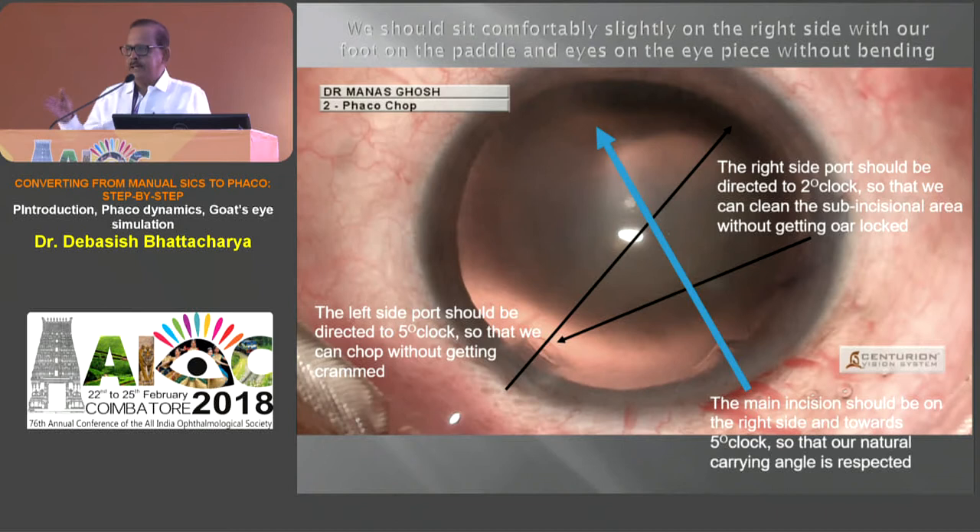Because we are right-handed persons and because of the carrying angle, we need to be seated comfortably — not crouched — in the microscope. Don't go too close because your hands get crowded in the field of work. And because of our right-hand rule, the main FACO incision must be from around 12 or 11:30 to somewhere around 5:30 — that's the direction in which we are comfortable running the FACO probe. The two ports should be two clock hours away from each other so as not to crowd both hands together.